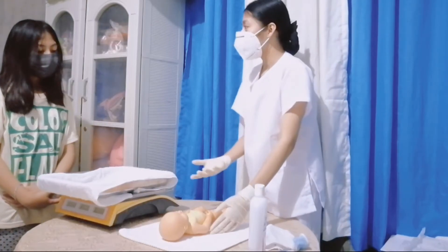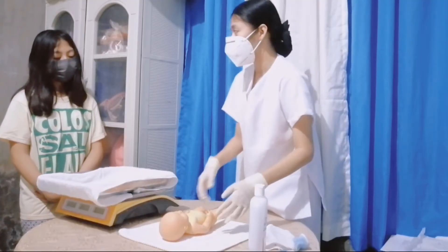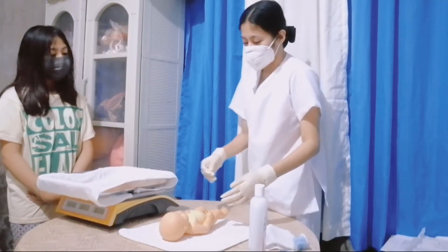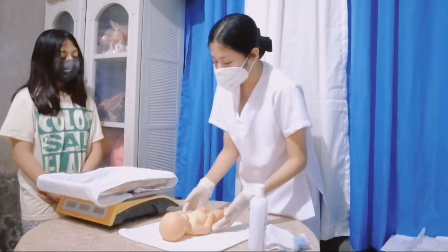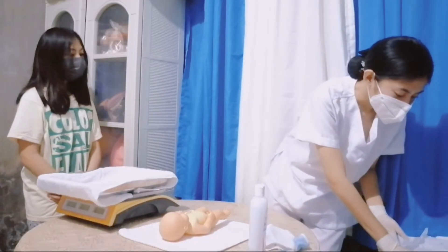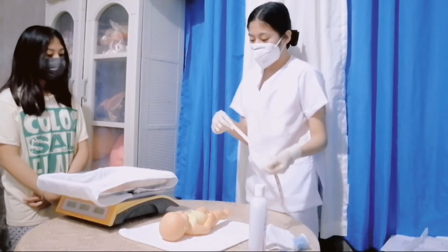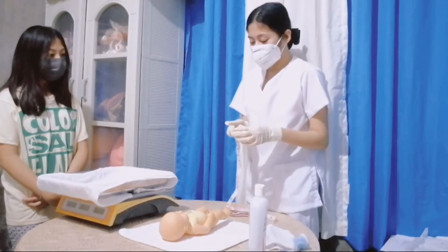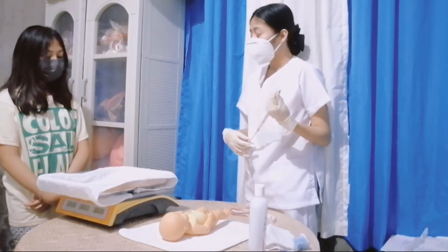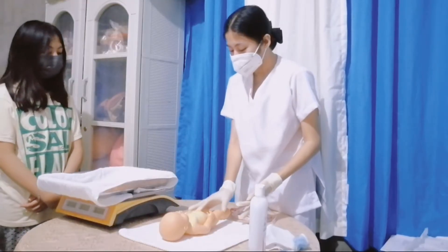But in some cases, there are babies whose weight is beyond the normal range. It is a condition depending on the mother's food intake while she is still pregnant. Now we will proceed with measuring the height of the baby. I will be using a tape measure to obtain the height of the baby. In measuring the height of the baby, I need the assistance of another caregiver to obtain the measurement accurately — one will hold the head straight and one will fully stretch the baby's legs.